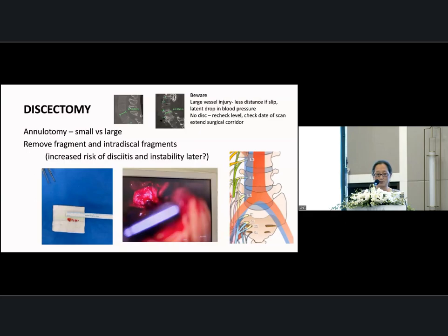If you don't find a disc at the time that you're looking for a discectomy, always recheck the level, check the date of the scan. Could the disc have healed up in the meantime?